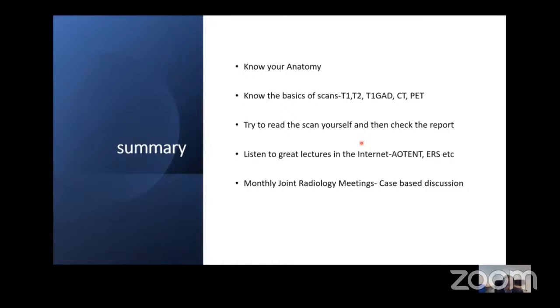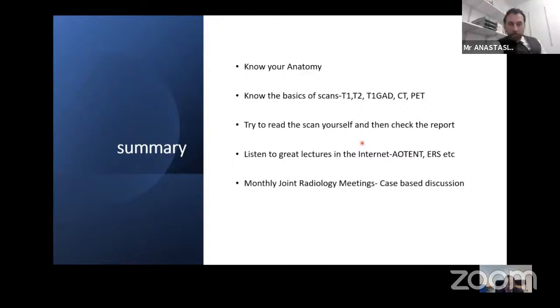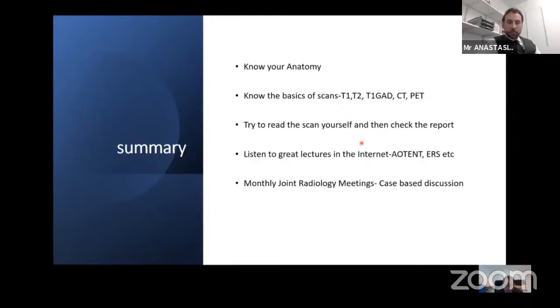So I'd like to conclude my presentation with the following points. Firstly, know your anatomy. Know the basis of the scans, of what T1, T2, T1 gadolinium actually give. Try to read the scans as much as you can yourself, and then check the report. And listen to some wonderful lectures on the internet. I find the AOT ENT lectures and the European Rhinology Society lectures very useful.